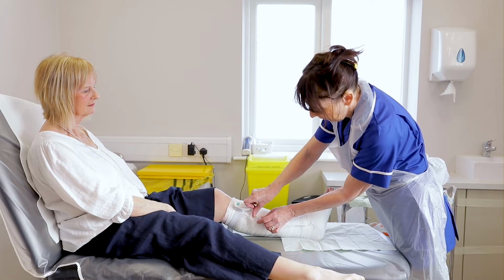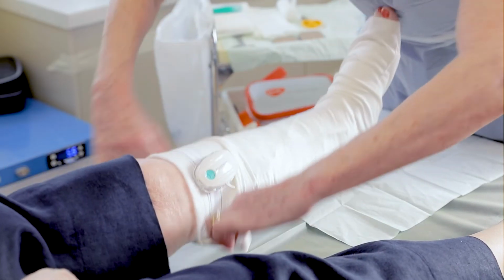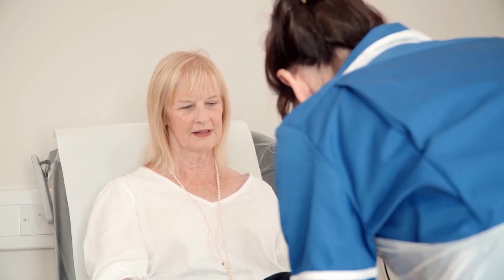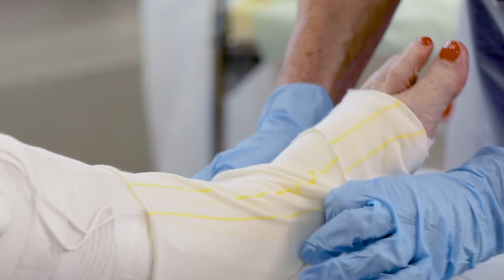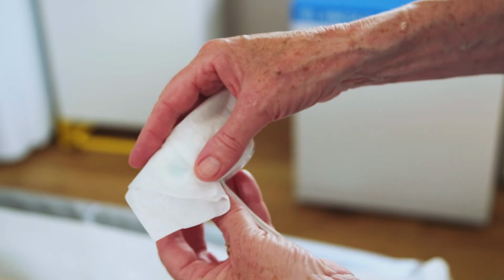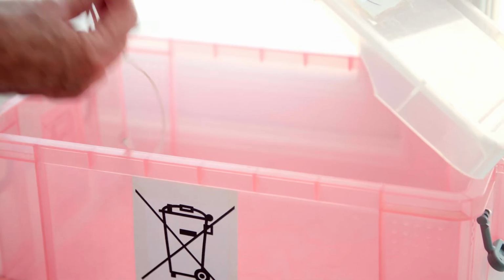The Accel-Heal Solo treatment device runs for the full 12-day treatment, after which time it will switch off automatically. The dressing and bandages can be changed according to clinical need and local policy. The electrode pads are disposed in clinical waste alongside the dressings. The device needs to be disposed of in a recycling facility.